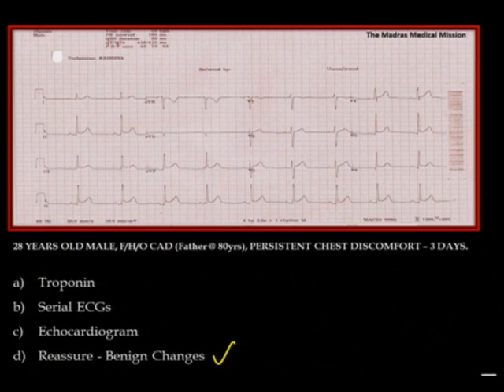a person whom you think has had a syncopal episode or a resuscitated arrest, or the person has a family history where the sudden death etiology was unknown. As long as these three entities are not there, I think still it is all right to continue to read these ECG changes as benign early repolarization changes rather than highlighting a very, very low probability of a sudden cardiac arrest in this patient.